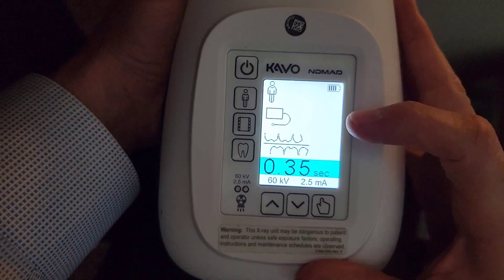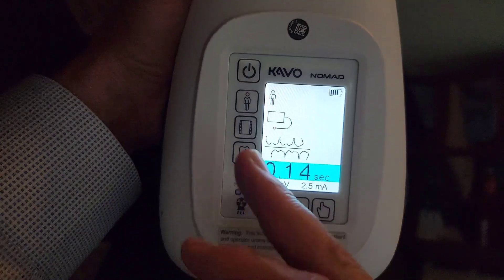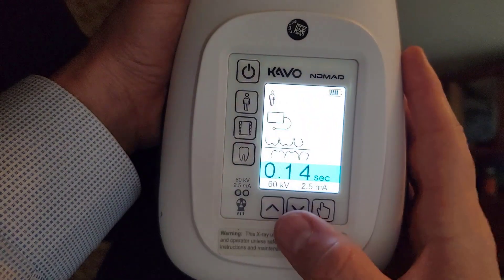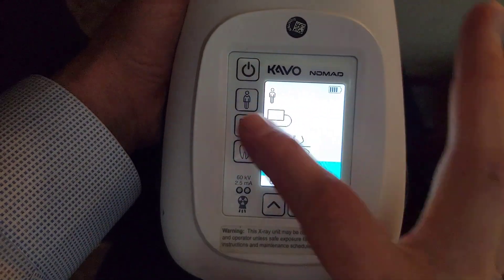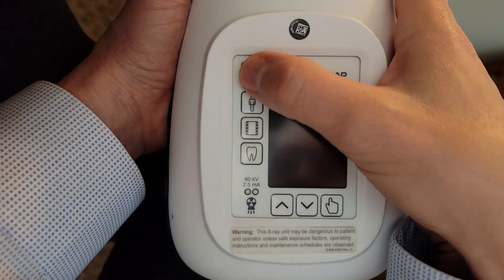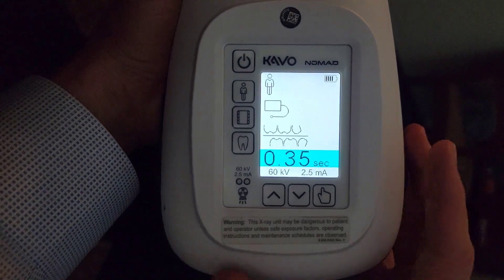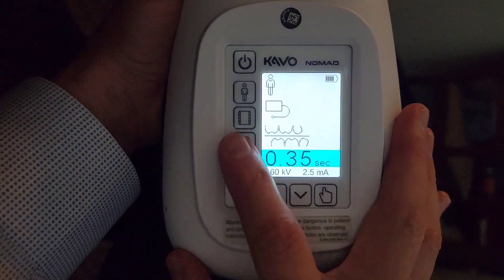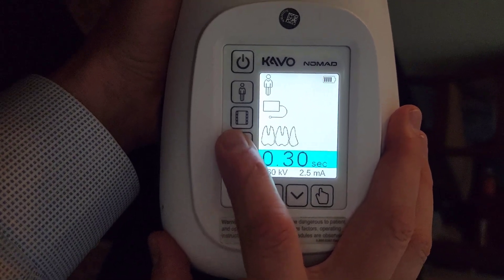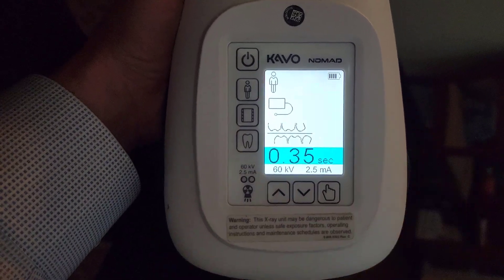That's pretty much all we use — the adult setting for digital. You can see it's going to be low as well for child, but as far as I know the students in clinic never use that setting — that would be really low. If I turn it off and back on, it should be set to what I just selected. There's the bitewings, the anterior PAs, posterior PAs. It's that simple.